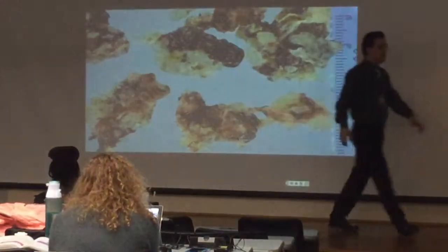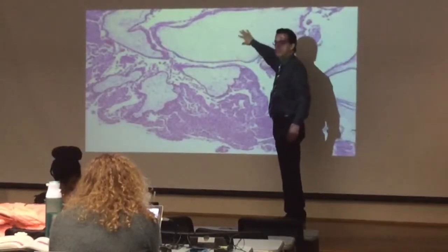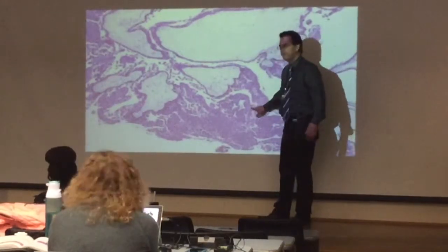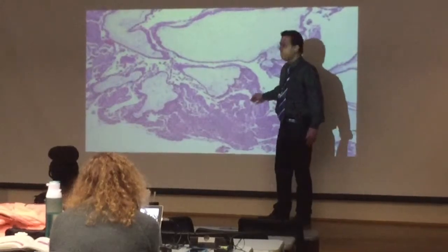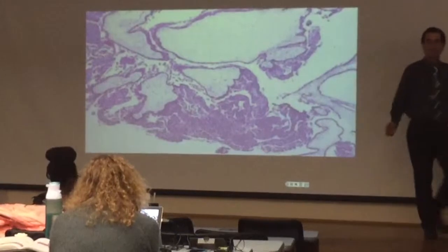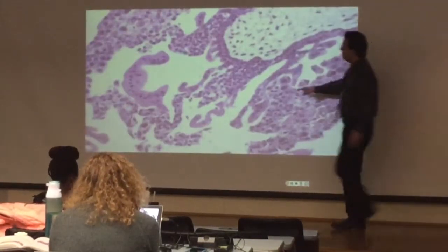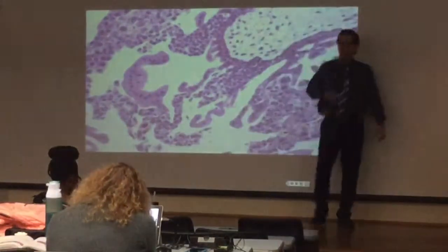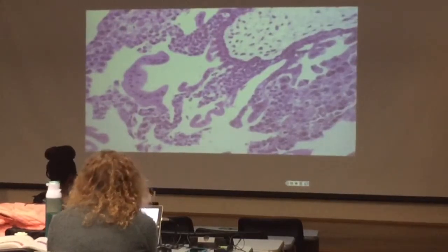When you look at them, they don't have any blood vessels and are dilated. They usually have this hydropic fluid, and there can be a space, but there is a proliferation around. You see cytotrophoblast and syncytiotrophoblast, and this is an extensive proliferation all around. That's the reason this complete mole is usually associated with a large amount of beta HCG. Syncytiotrophoblasts are the cells producing that beta HCG, and the cytotrophoblast is again all around, surrounding these dilated villi, these grape-like structures.